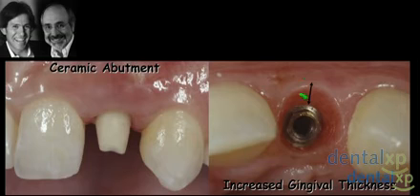Thickening the tissue, as you see on the right slide, by at least 2 millimeters. We know this from Ronald Young's work. And then also dealing with it from the ceramic side by having a ceramic option as an abutment. Obviously, the question is, do you need the ceramic abutment over here? And we know from Ronald Young's work that probably 2 millimeters thickness or more makes this non-discernible.